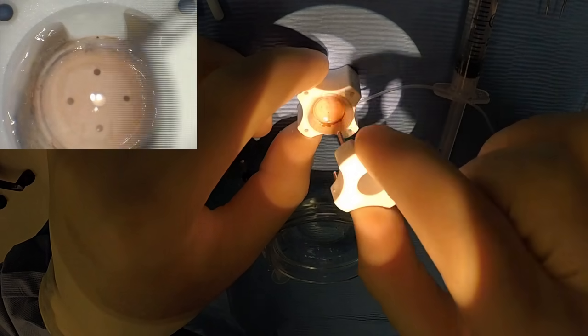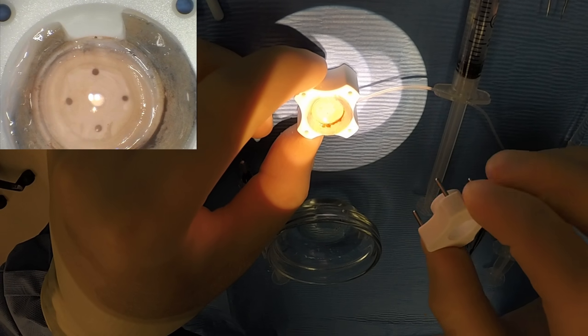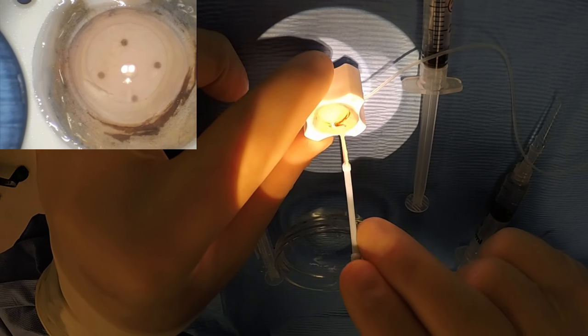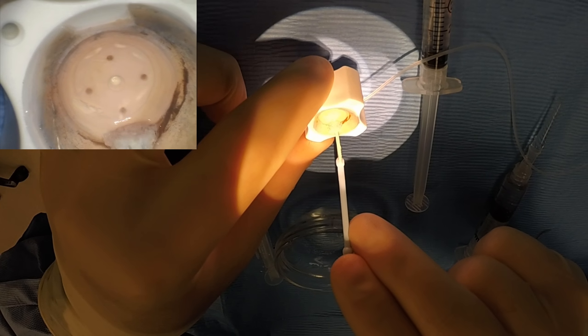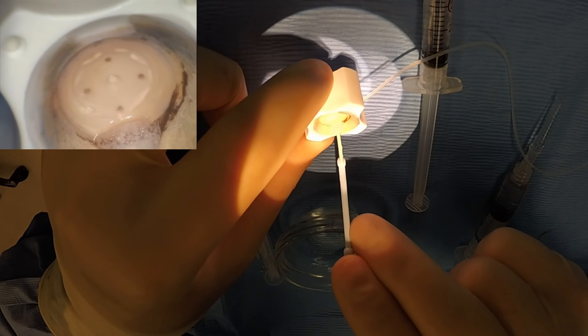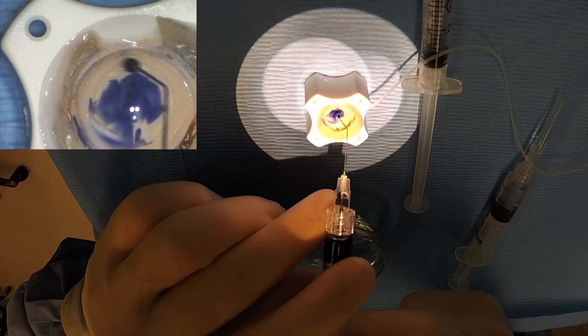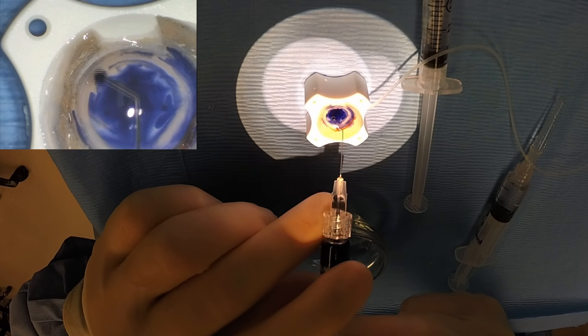My assistant engages the vacuum, which is helpful to have some counter-traction when lifting the graft up. I remove any Optusol that's remaining from the surface of the graft and just stain it around the edges so I can see the edge and pick up the edge.